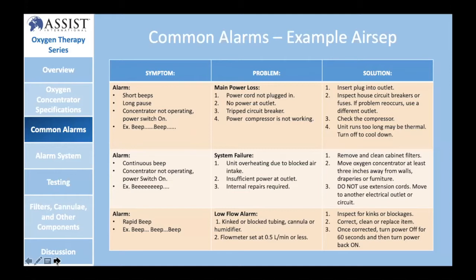We also have several modules that go in depth on the maintenance and repair of oxygen concentrators. And so if you have biomedical engineers or technicians who work at your facility or who work in your district or even in your region, please refer them to our resources. We're happy to share that with them. We have recorded sessions they can participate in and see how to perform in-depth repair and maintenance of oxygen concentrators. With that being said, we want to touch on a few key alarms that you can be aware of.